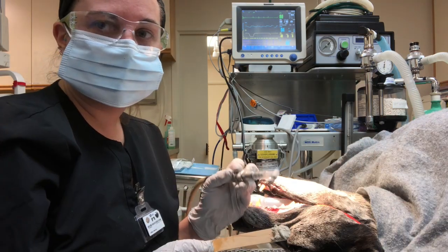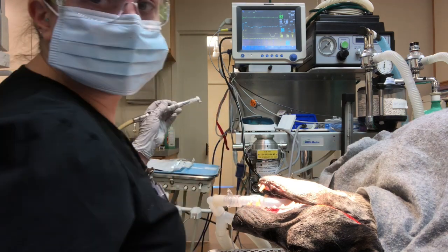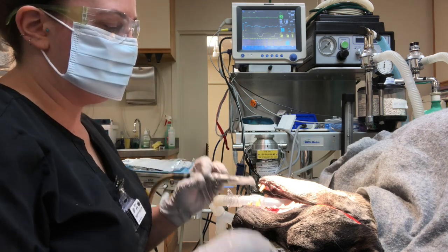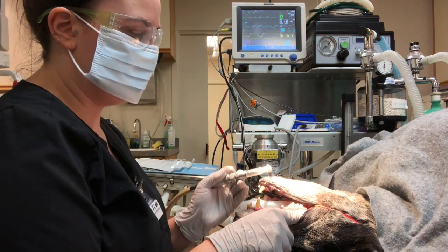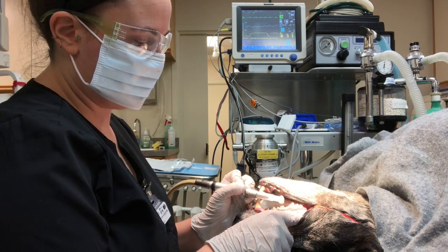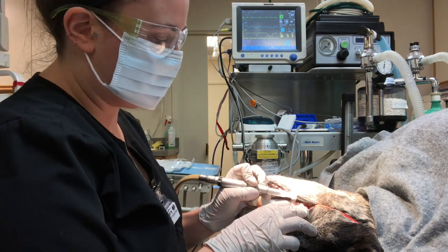When you're ready to polish your teeth, you want to grab your prophy paste and you want to fill up your cup here. And you don't want to keep it on the tooth for longer than 3 to 5 seconds because it can warm up the tooth too much and damage it. So what we're going to do, start it a little bit. And don't forget to reapply some prophy paste.